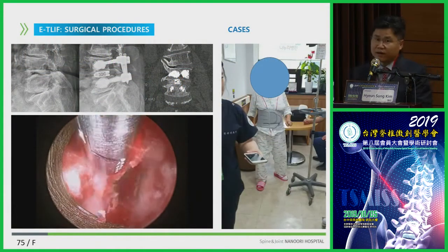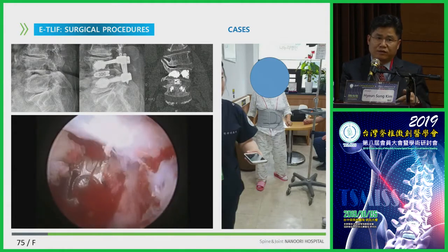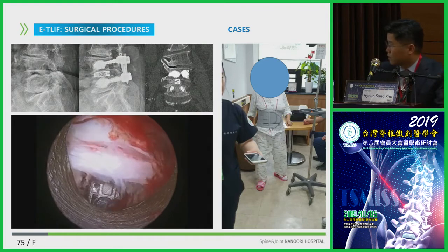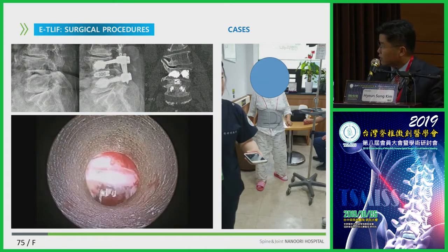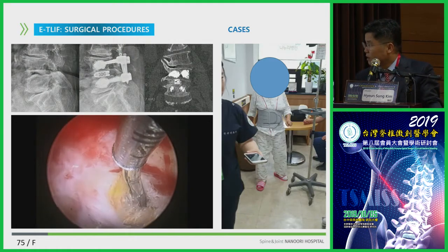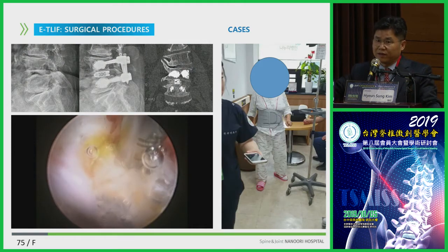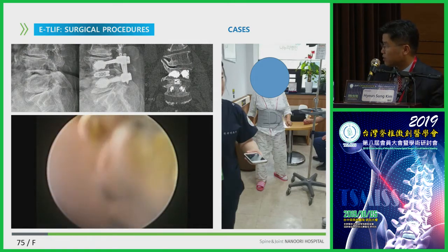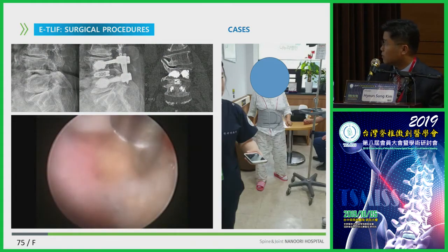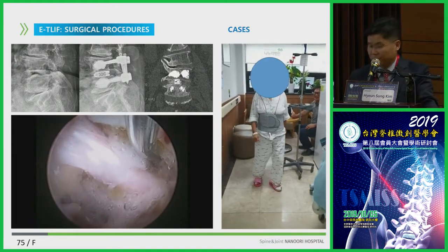But anyway, all kinds of surgical procedures have complications. Endoscopic surgery also has some complications. This patient also had a big dural tear. But as I already mentioned, in spite of the big dural tear, endoscopic procedures are very narrow procedures, so only insertion of a patch to here, and the patient had no problem. Two days later, the patient walked with no problem.